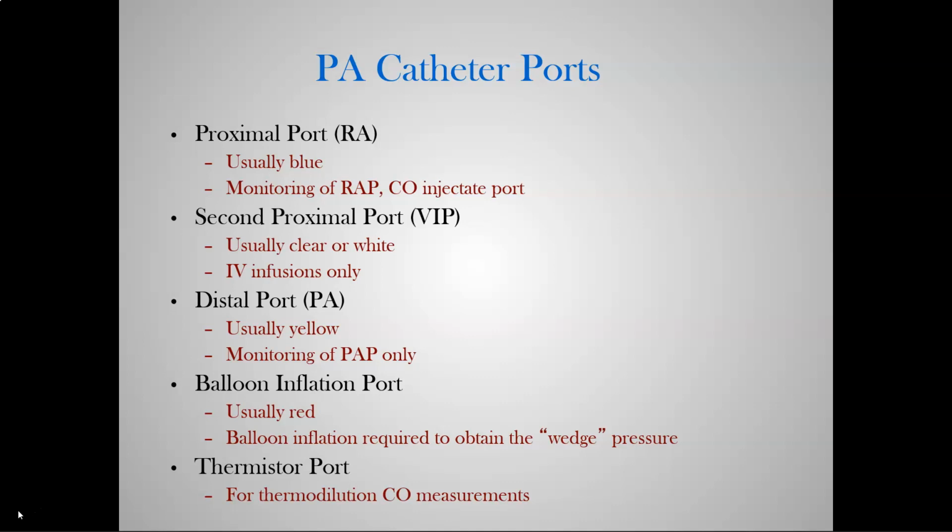After the distal port, we have our balloon inflation port. This one, I put a big star next to, not purely for testing, but more as a red flag. This is a very important port, a very critical thing to monitor and pay very close attention to, because this port has the ability to really harm the patient if used improperly or if something goes wrong with it. Our balloon inflation port is usually red.